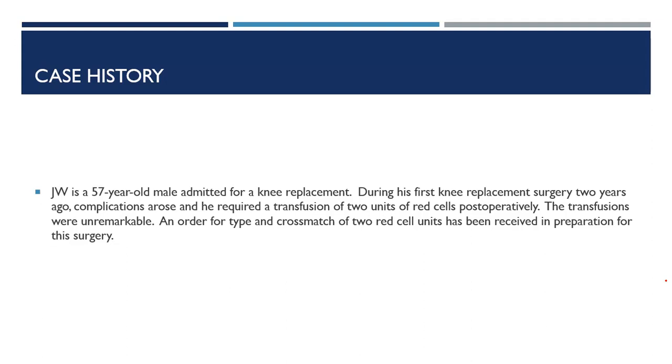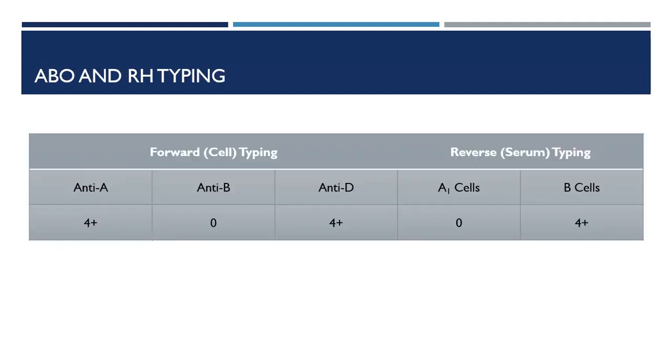The transfusions themselves were unremarkable, and we now have a current order for a type and crossmatch of 2 red cell units in preparation for his next surgery. So let's move to the next slide.